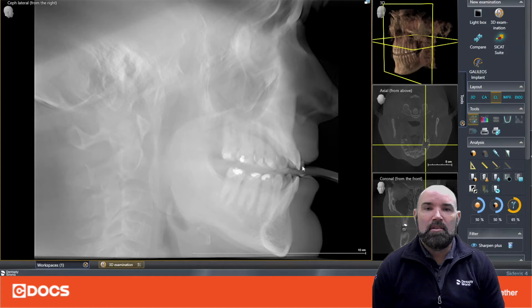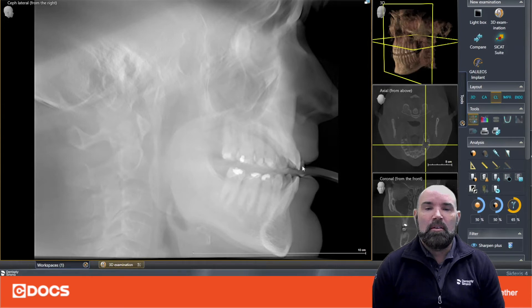Clicking on the CL button will give you a lateral ceph, and we can use this for orthodontic and orthognathic evaluation as well as some restorative implications with interincisal angle. So it's a nice field of view to utilize in your practice.